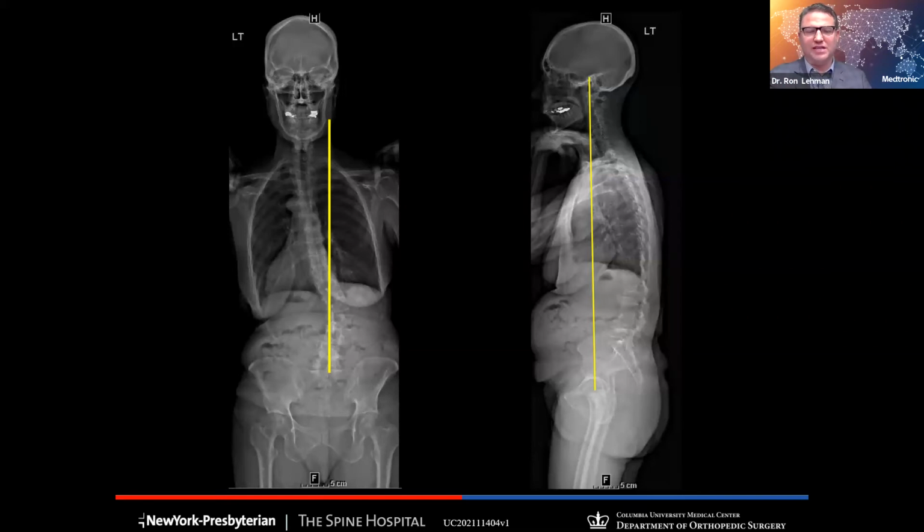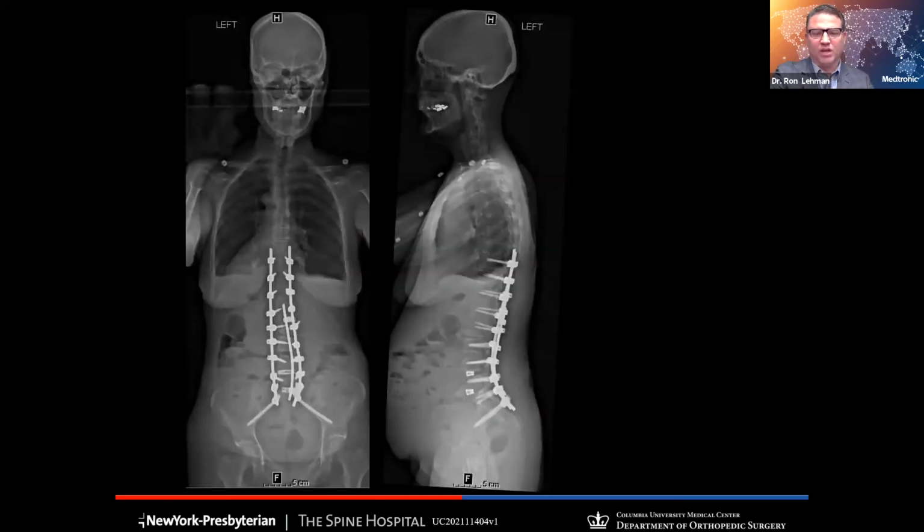I've actually staged more cases in the last couple of months than I have in my career, and I really like the fact, especially when a patient has radiculopathy pre-op, to be able to assess that in the intervening segments. It's really nice that you can break this up from a 5 or 6 hour operation into a 1.5 to 2 hour operation, then you come back for 3 hours. If you don't have to do any neural decompression, those things take some extra time, especially if you're going to use a fancy hybrid construct, certainly like Neil would, where he's going to place percutaneous screws and do some facetectomies, but not open everything up like I would typically end up doing for a case like this.